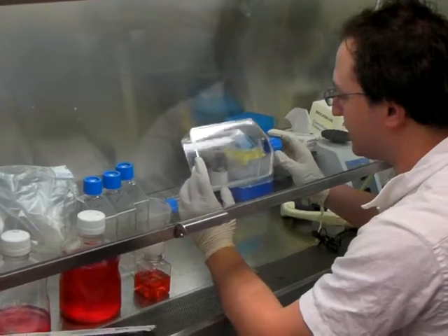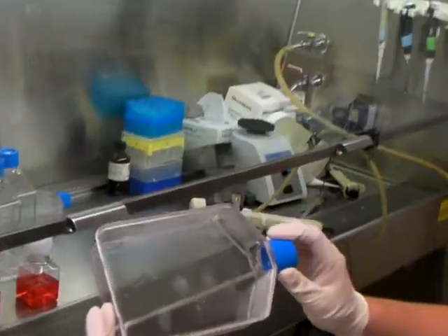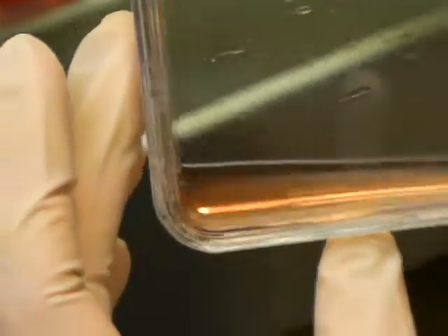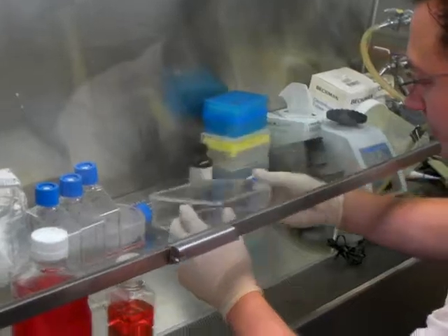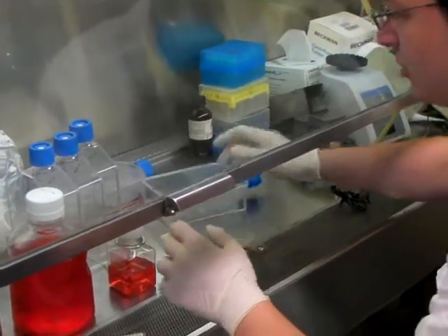And you wait for your cells to fall off. It depends on the cells, but these are pretty big so you can actually see them — I don't know if you can see them on video. You tap them once in a while, depending on the cell line; some are hardier than others. These are all falling off already.